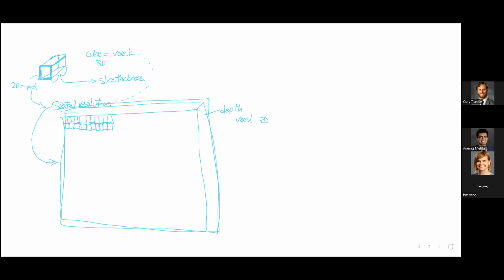One, you create a term that gives the total distance that you're going to cover, and that's called the FOV. Does anybody know what that means? Field of view. Okay, it's the field of view.